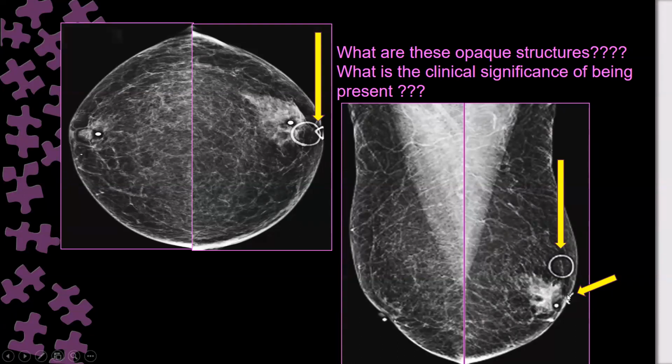But what about these two types of markers? The triangle is used for what, and the ring is used for what? Do you know? I think the triangle is for a palpable breast lesion felt by the patient.